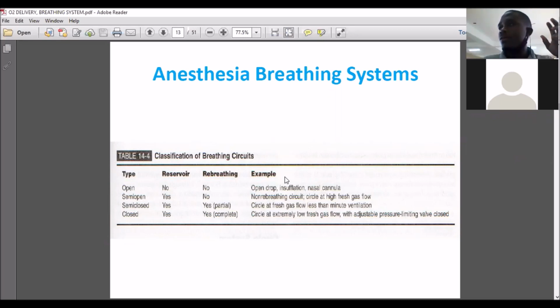Now, if you've understood it, which one would be best for the kids? Which system is best for kids? Which one do you believe is for kids? Semi-closed, and for you? Closed. The two semis. Which is the best semi?